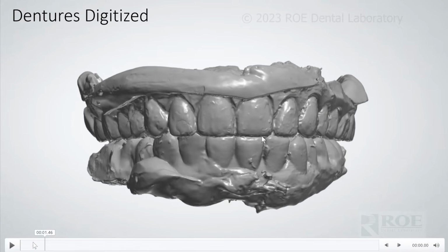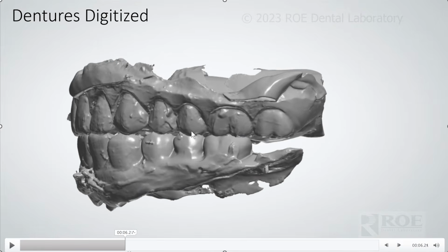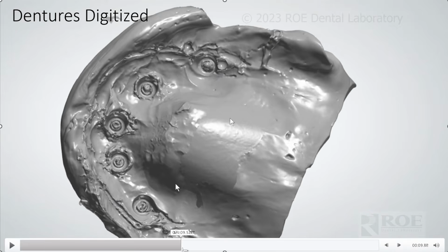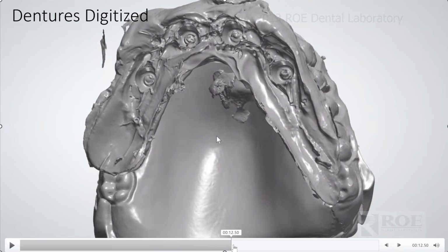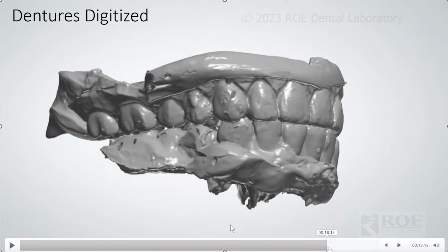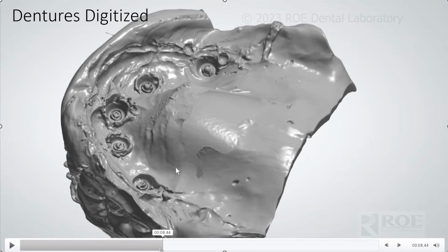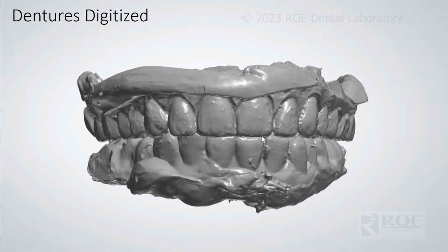All right, so based on that, we took this back in the lab. We have all of our records. All right, looks good. We captured the healing collars, both sides. We have the bite, we have the teeth, we have the smile, the tooth position, the midline. We have everything we need to make this case. It's a really nice way to do it. Yes, this looks a little messy, but for us, we can geek out on this and make some upper lower restorations really quickly.